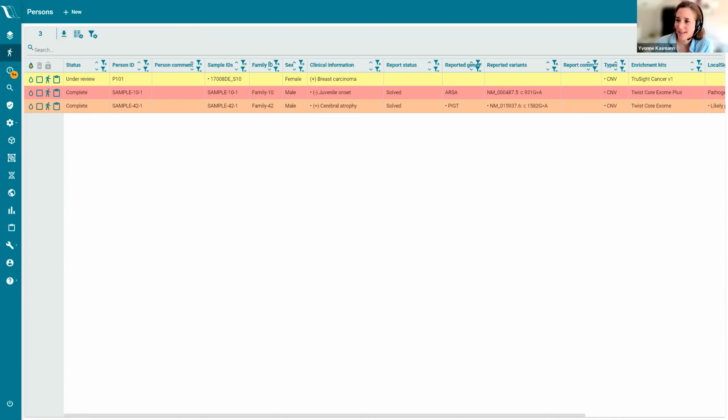Another question is, can Varvis suggest an ACMG or AMP classification? So you just have to check the criteria, or do you always have to select the criteria yourself? Lena, would you like to take it? Yeah, I can. So right now you have to select the criteria yourself. We don't do a classification.